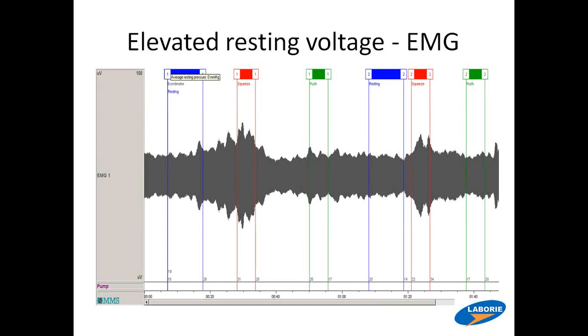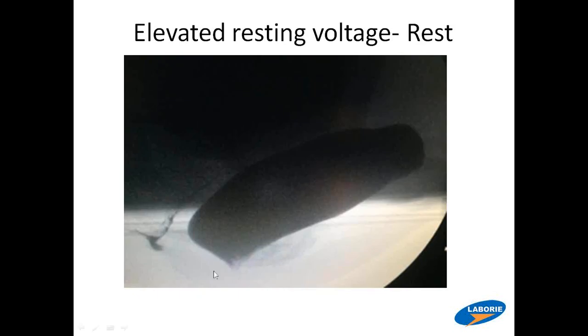wrong with them. And the defecography, this is a pretty normal contour. There's the rectovaginal, there's a contrast in the vagina, and that's normal rectovaginal septum. This is a pretty normal contour, except you see the beginnings of a small rectocele here and a nice tight anal canal there. Minimal lift of the pelvic floor with squeezing. We always look for the real pickup of the pelvic floor and accentuation of the anorectal angle.